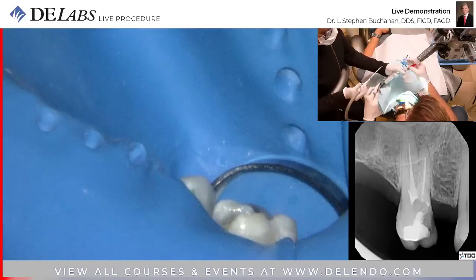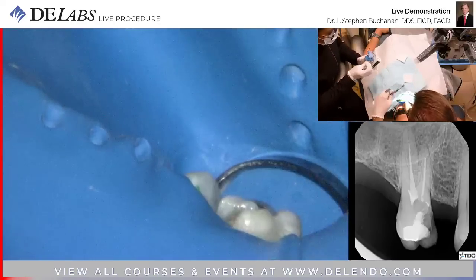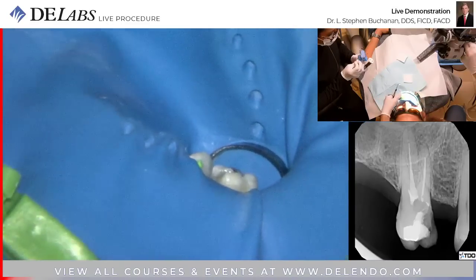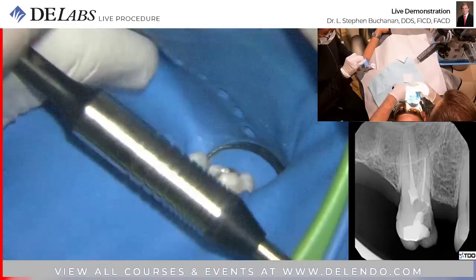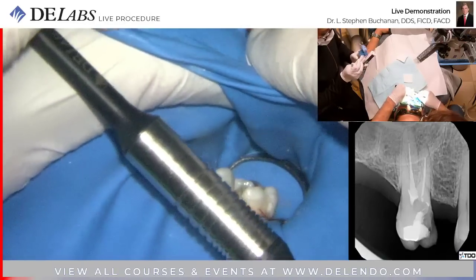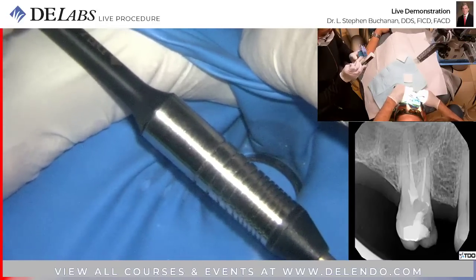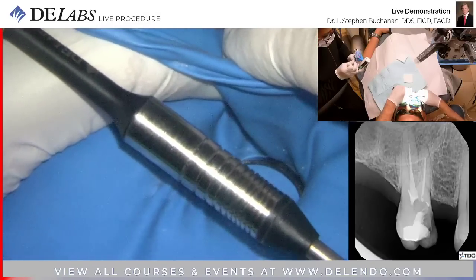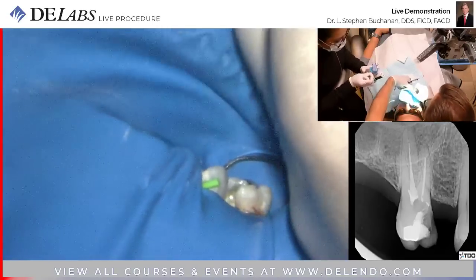Okay, let's gauge the MB1. This rubber dam, by the way, is awesome. This is an Optidam. It's got these little blebs on them that you just cut, the one that's so appropriate for the tooth, and you don't need a rubber dam punch. I hate my rubber dam punch. All of them have a nick in them. Not one of them cut a hole without a hanging chad. So you just clip this. Not only do you not need the punch, but then you have like a little turtleneck sweater around it. You get a better seal around the tooth.